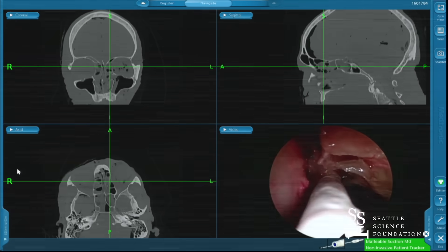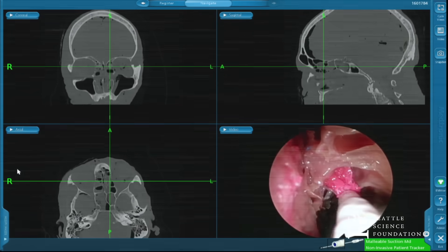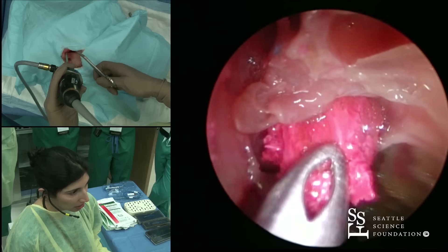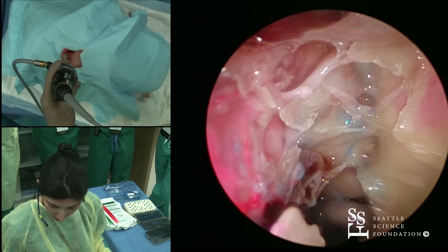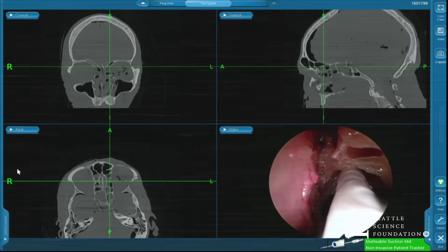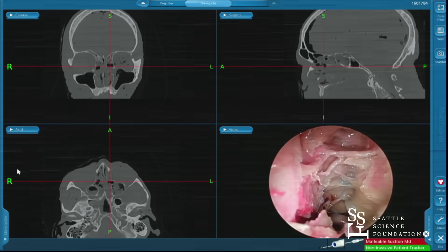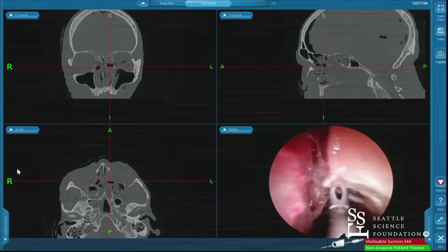Let's just get some of this gunk out of here so you can see a little bit better. I'll take a 45 Blakesley. I'm just removing some of this latex-y stuff so you can see the septations a little bit better as we come forward. I want you to keep looking at that navigation, although the navigation is a little bit off. We're going to take a 45-degree through-cut. This 45-degree through-cut is my general tool of choice coming up the skull base from posterior to anterior.